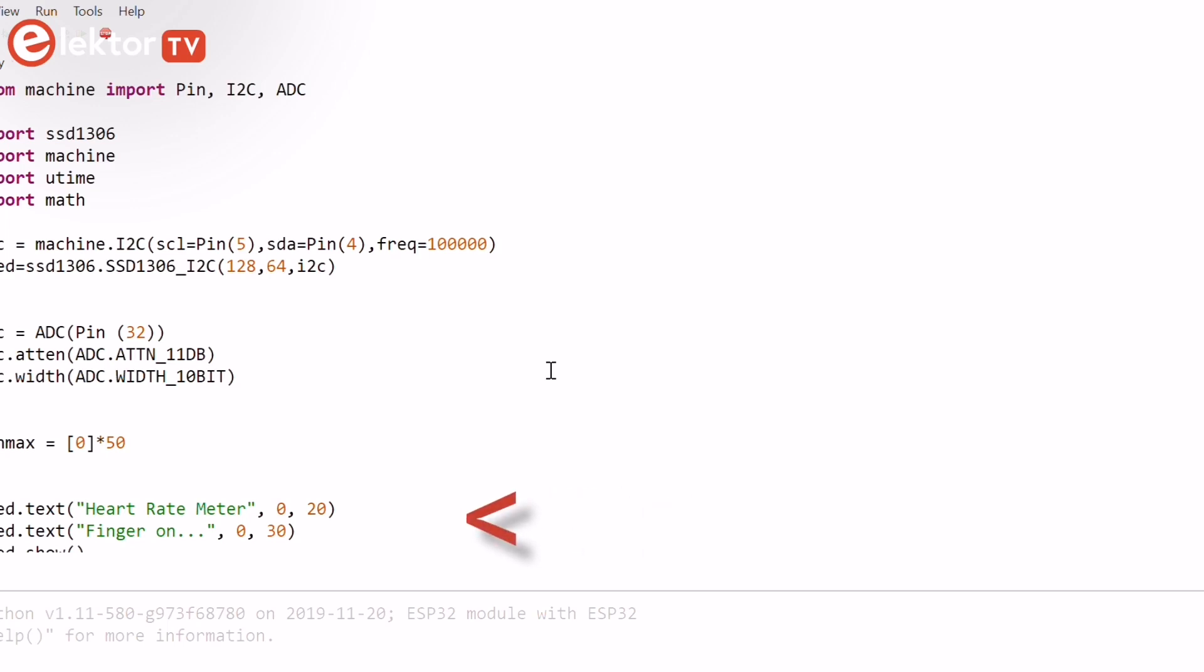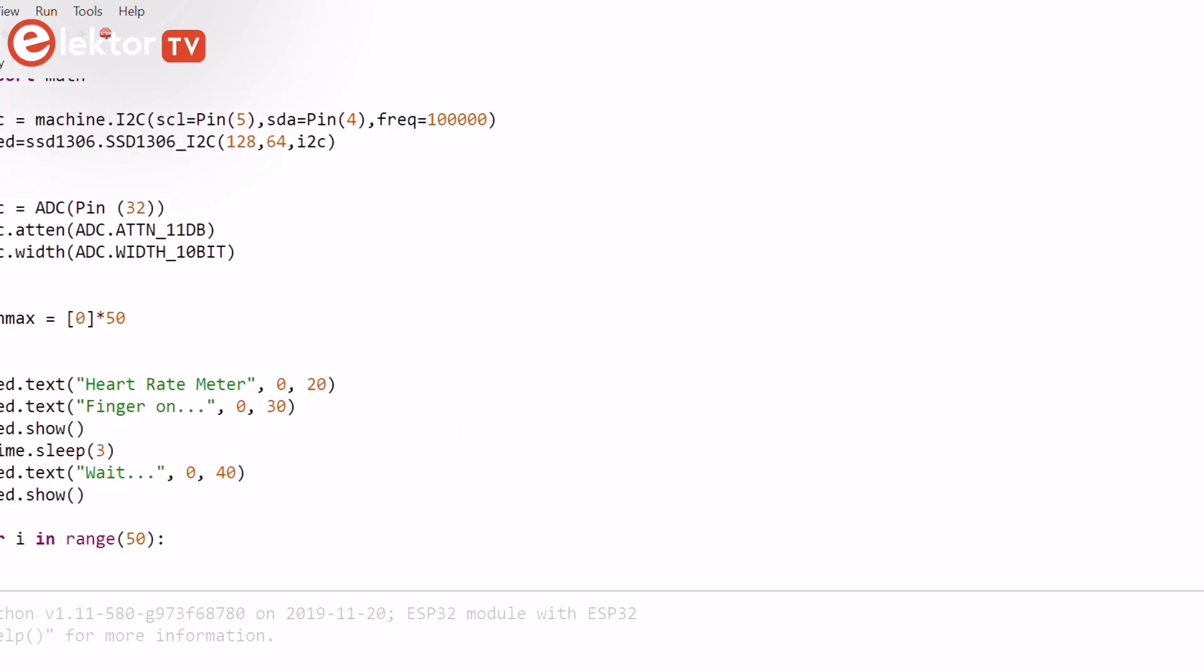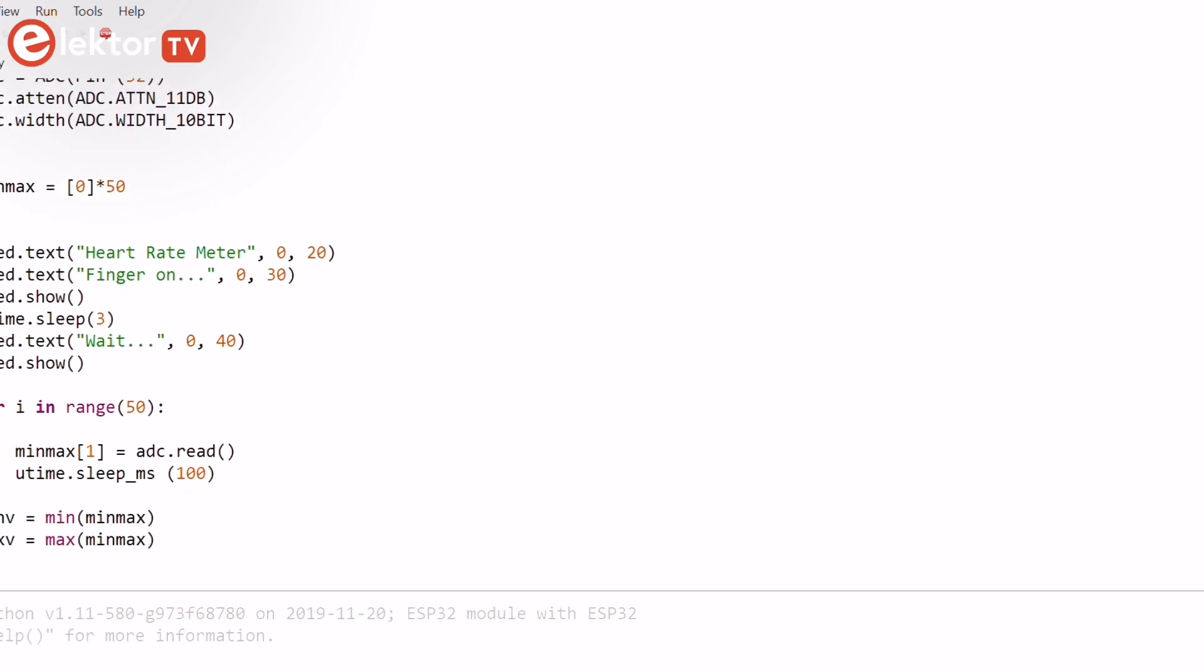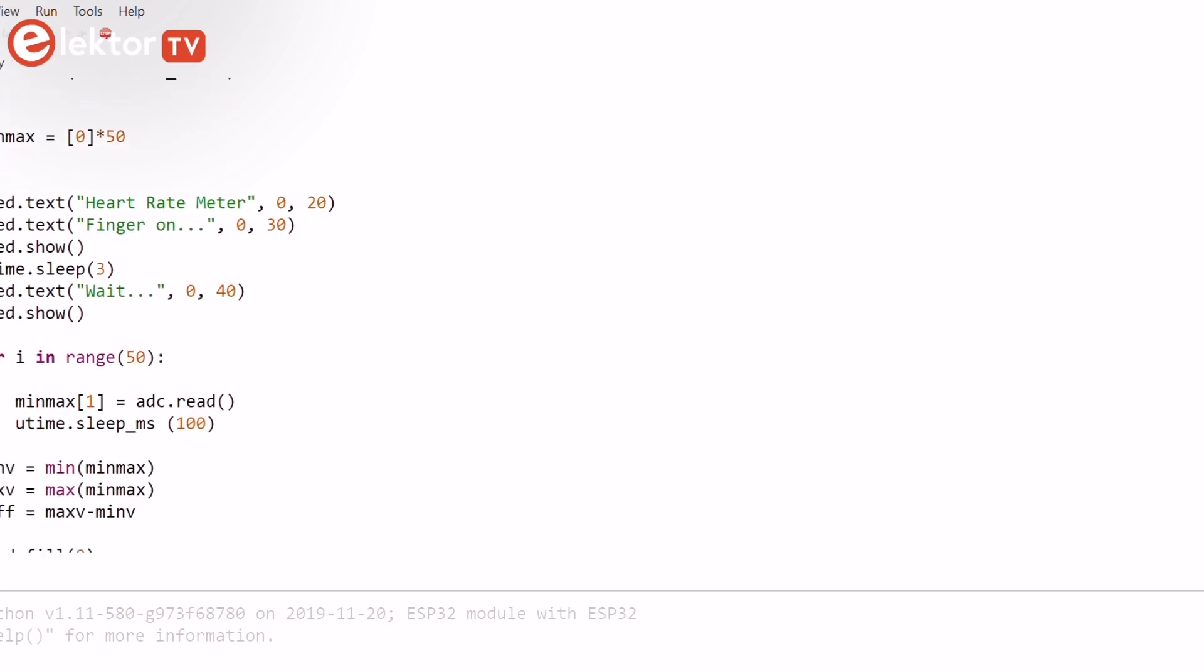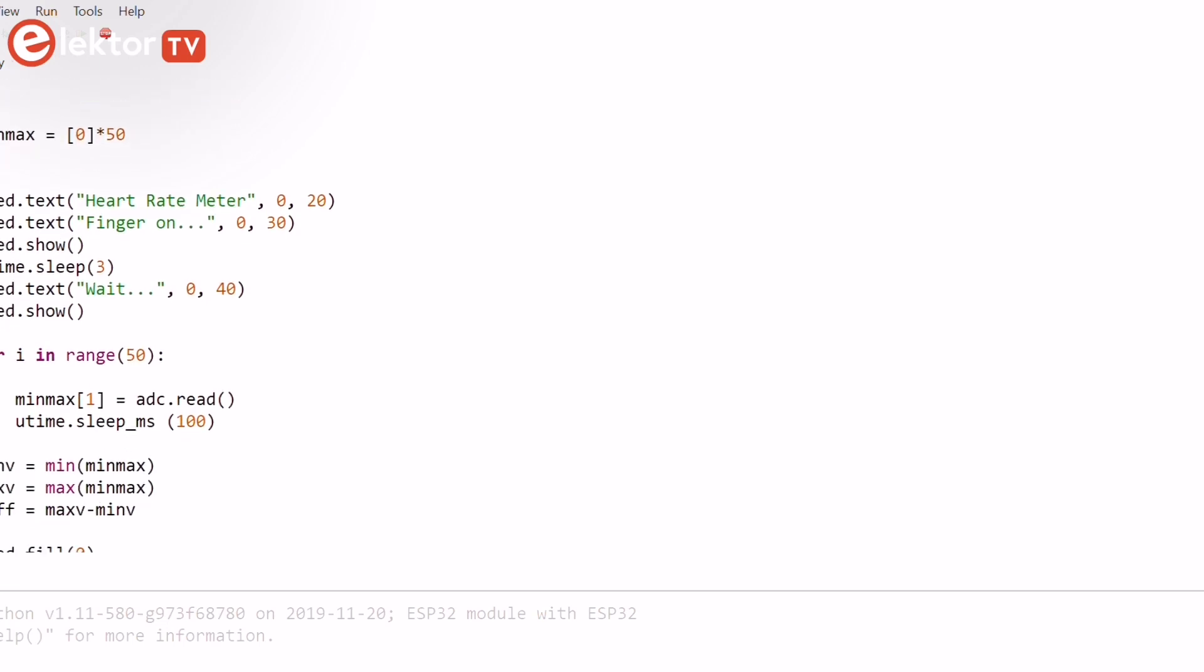Then a message is displayed on the OLED and the user is prompted to place his or her finger on the pulse sensor. The program carries out a calibration for five seconds and calculates the maximum and minimum values read by the ADC. The values are stored in variables maxV and minV respectively.